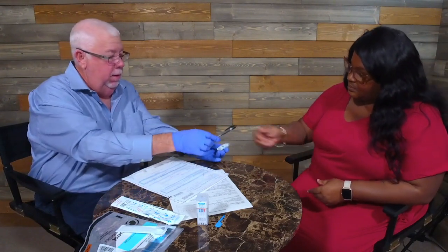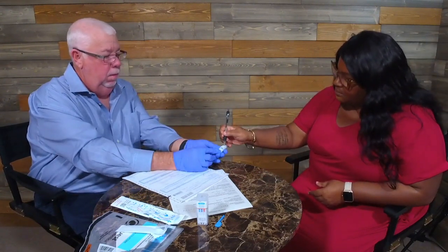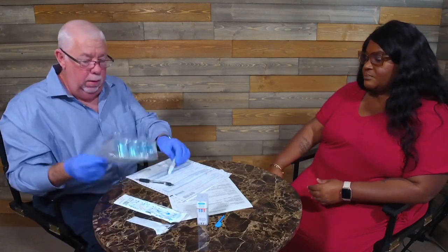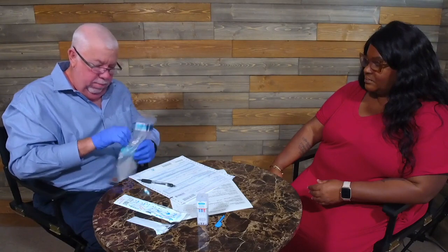Okay. Thank you. Okay. And I'm going to have you just stick your initials on there at the very end. And I'm going to go ahead and date it. Okay. I'm going to put it in the bag to go out to the laboratory. And I'm going to finish my custody and control form.